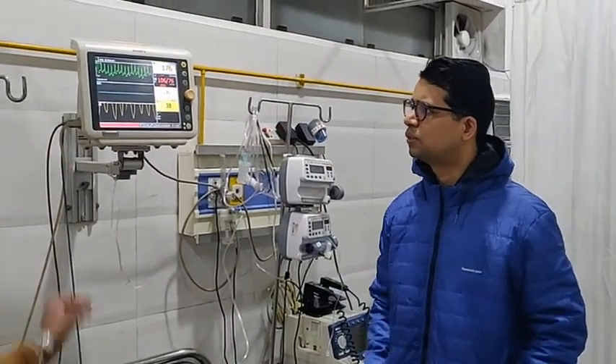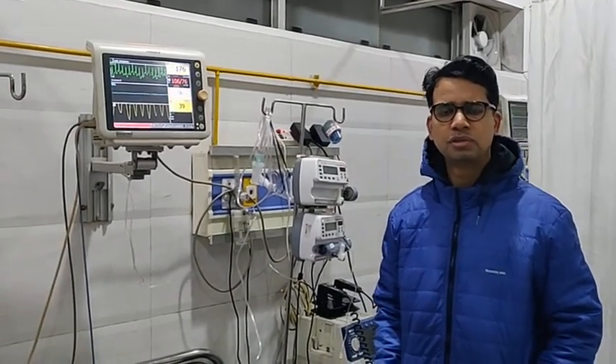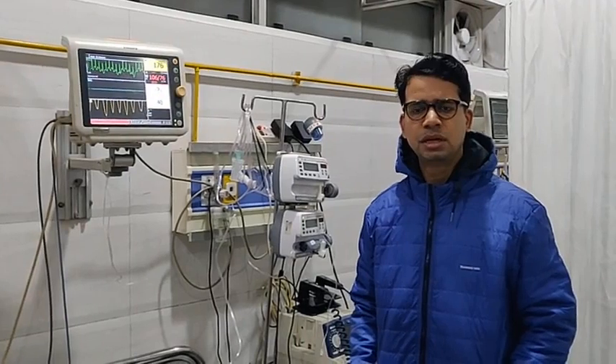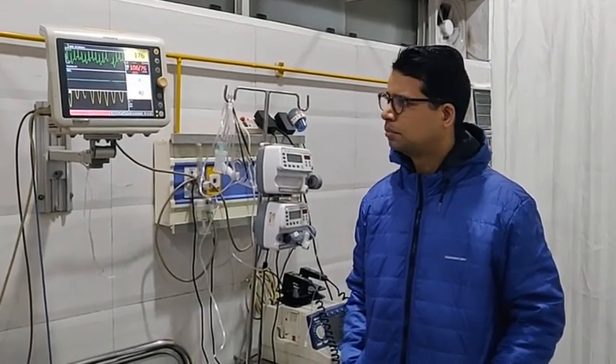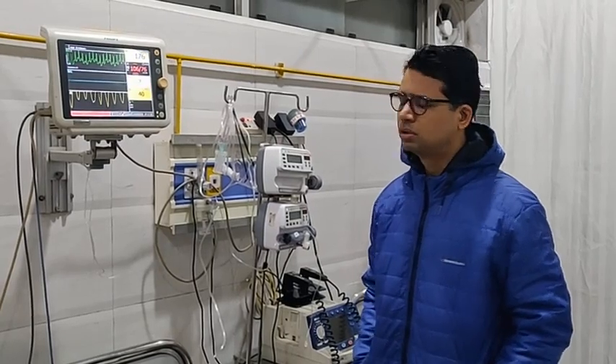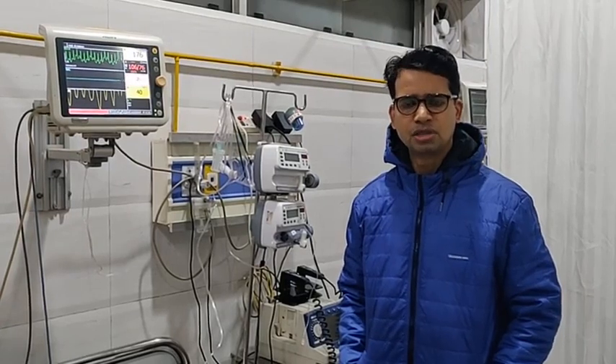You can see on the monitor the heart rate is around 176. We have tried with all those medications which can terminate PSVT, like Diltiazem, Amiodarone, and Adenosine. But still he is having a heart rate of 176 and is severely symptomatic in the form of hypotension and breathlessness.